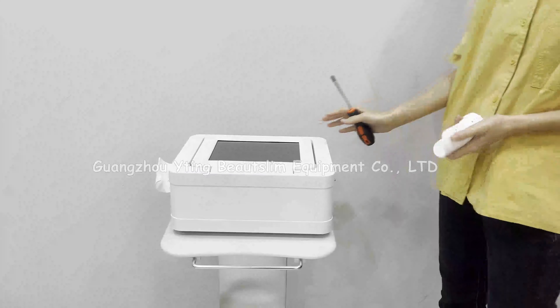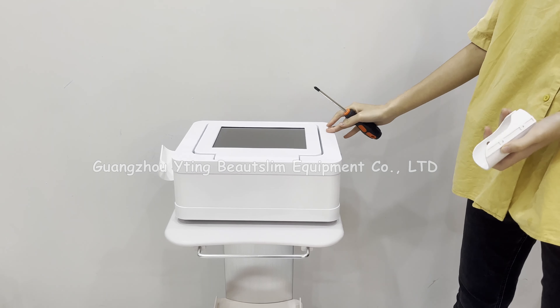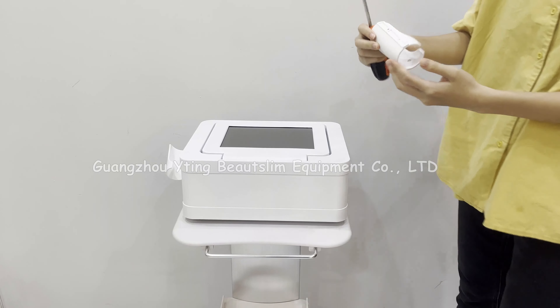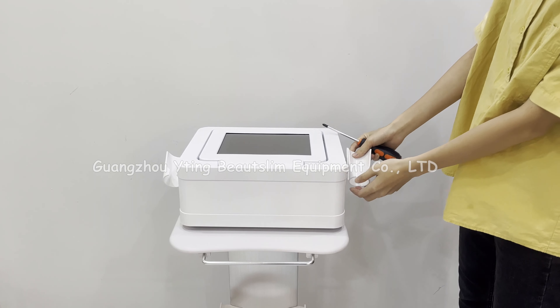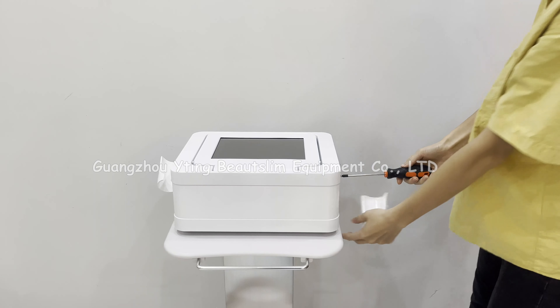Now we install the two-in-one HIFU vagina tightening machine. First, install this handle holder. You should connect this side to the machine. We unscrew the screws.